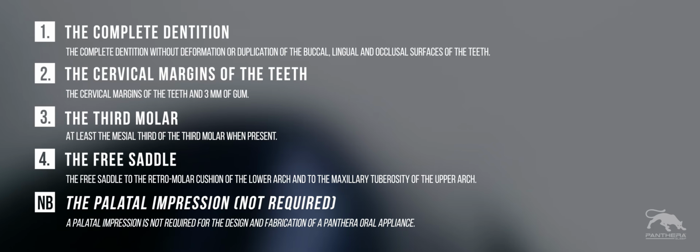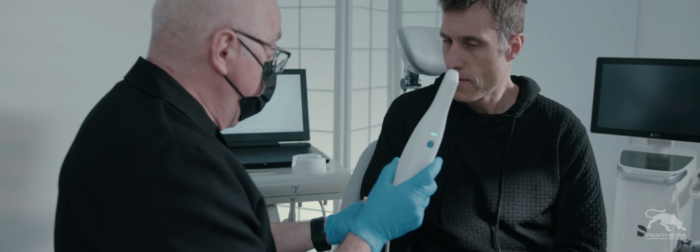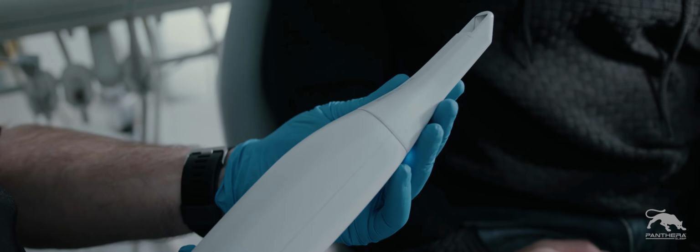A palatal impression is not required for the design and fabrication of a Panthera oral appliance. For an intraoral impression, a scanning procedure must be followed for optimal results. Each scanner model has its own particularities. Pay attention to the manufacturer's instructions.